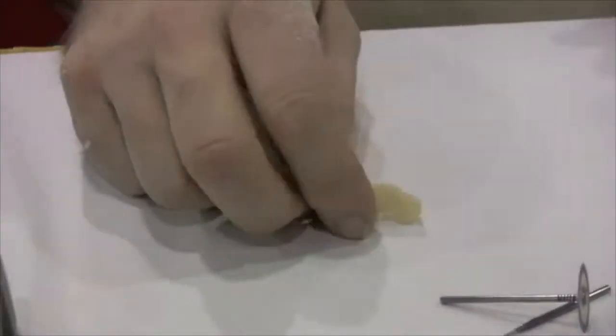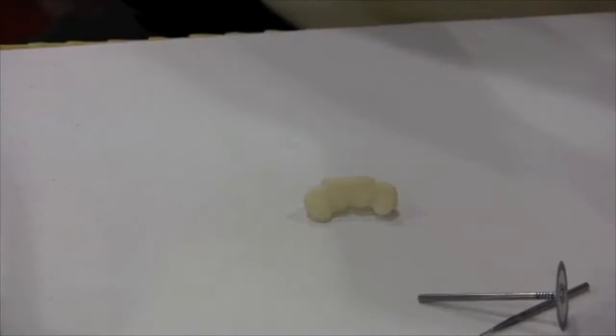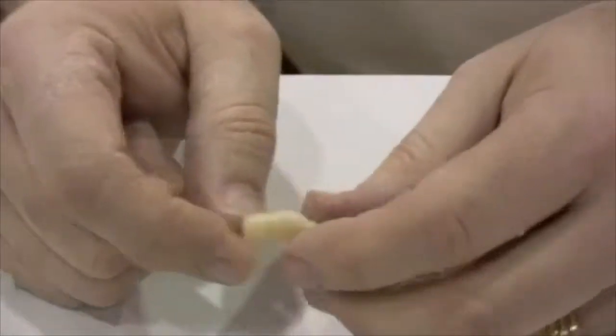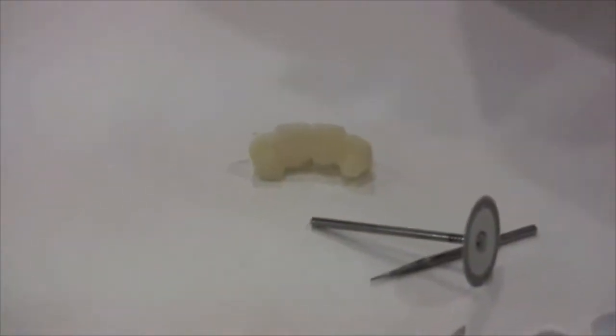One thing you need to remember about bisacrylics, methyl methacrylates, any type of temporary material — they are porous. So even though you have a nice polish, if the patient is going to be wearing these for any particular amount of time, there is the potential for staining.